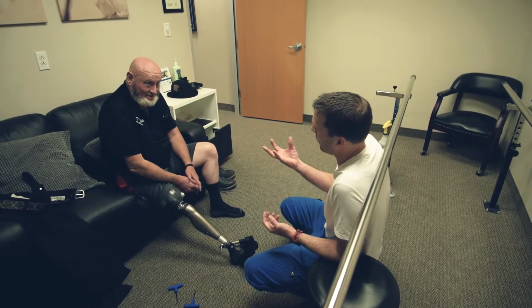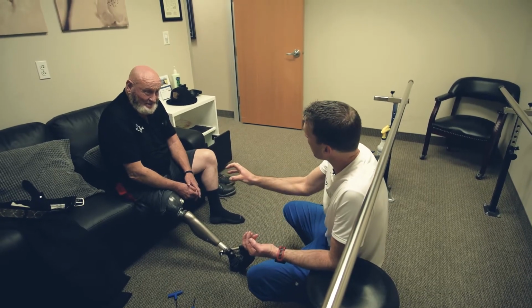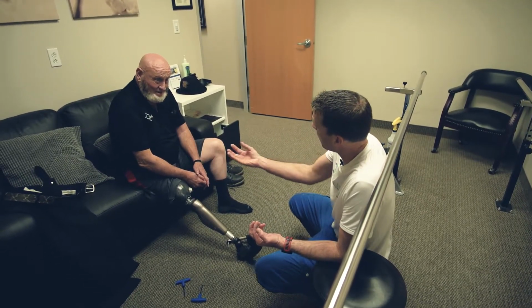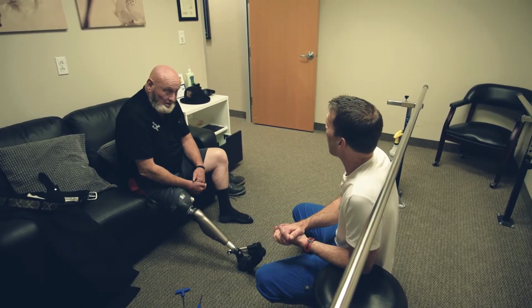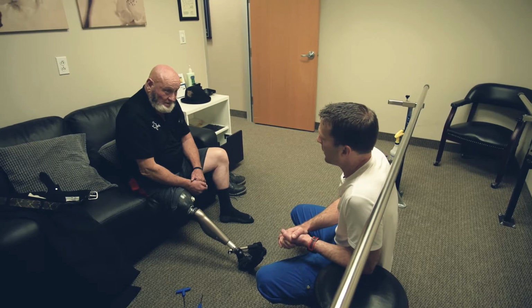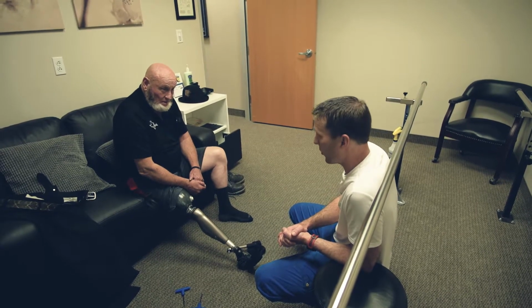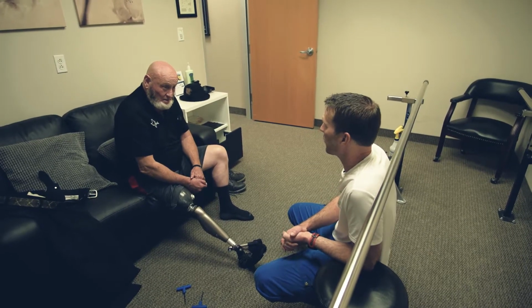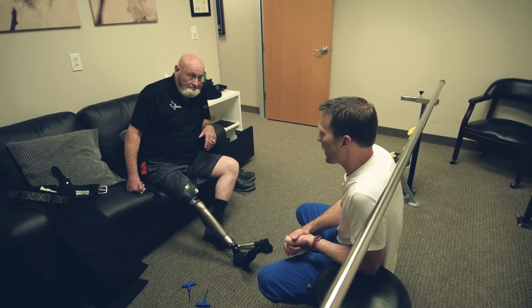Right now, I'm trying to get a prosthesis or a socket built so that when you move your femur, that force in the femur is then transferred into the prosthesis, and that's very hard to do with soft tissue. So osseointegration is like instant. When your femur moves, the prosthesis responds, and so I much want to get that if I can. But like I said, it's a process.